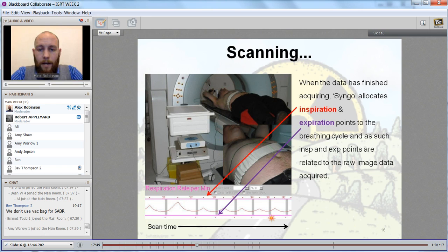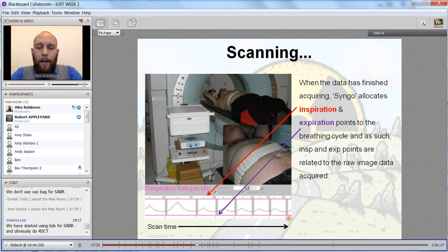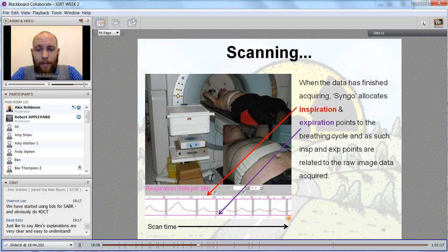It's quite important that our patient has this regular breathing motion, and a lot of people often consider trying to train their patients, giving them coaching. The only issue is that if we're training a patient to breathe in a certain fashion for the pre-treatment scan, then that should be mirrored when we start the treatment. Otherwise, we're just causing inaccuracies and variabilities between each of the procedures.